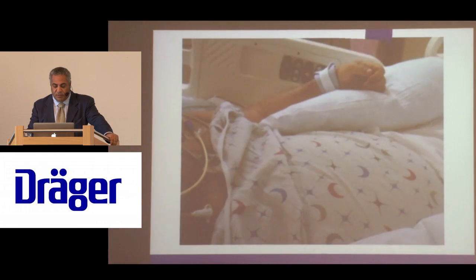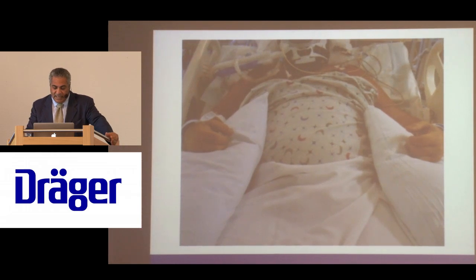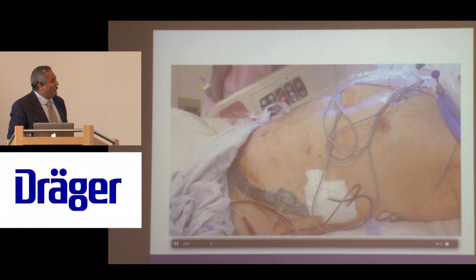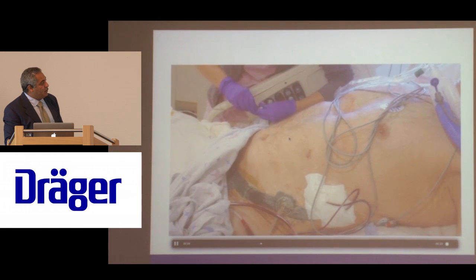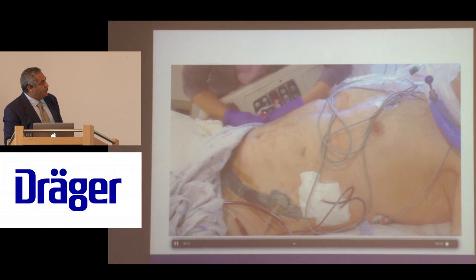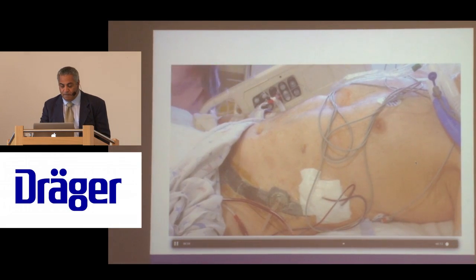I think you've probably seen, hopefully you were able to see what I was pointing out. Okay, so I won't torture you with more videos then. Okay, one more. I think this patient is good for the chest bounce. So you can see very subtly the squeeze and then let go. Very subtle chest bounce.